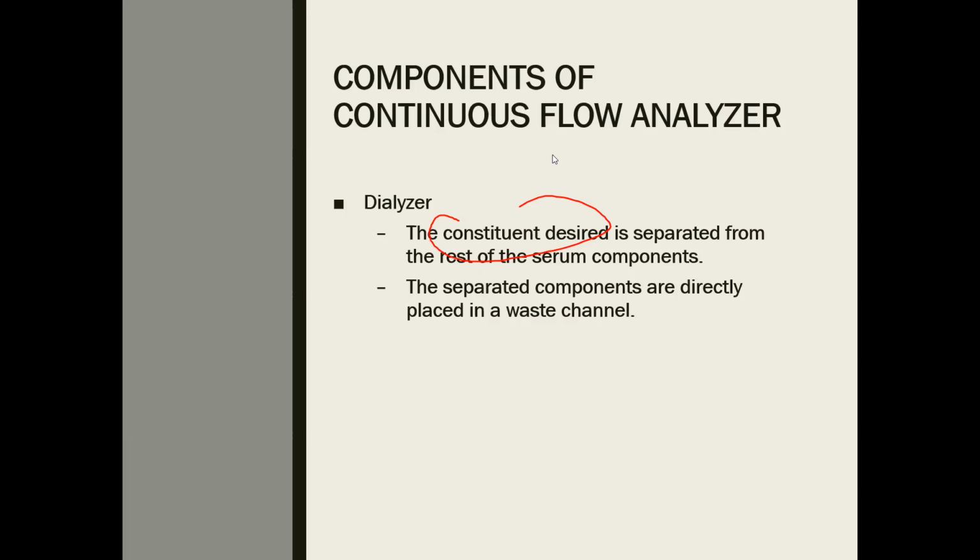That is the purpose of dialyzer. And the separated components are directly placed in the waste channel so that it will not cause a carryover in our sample. When we said carryover, yun po yung parang waste na nanggaling dun sa previous testing or sa previous analyte na ating tinest or sa previous sample na ating tinest.